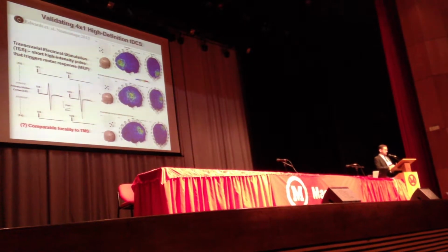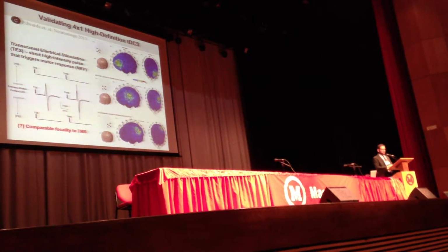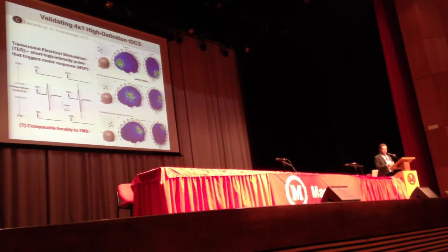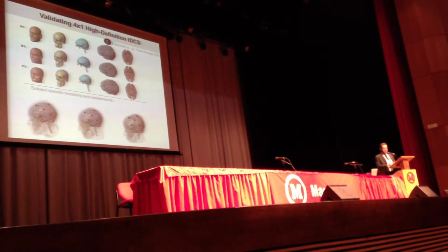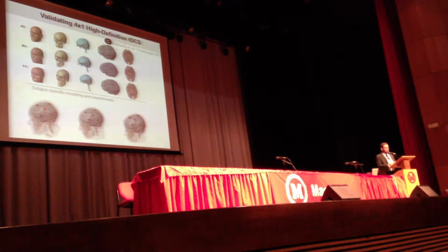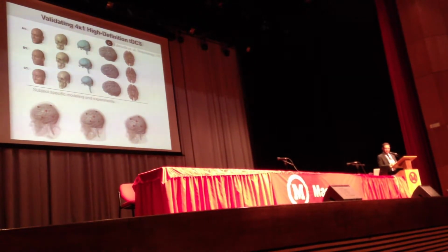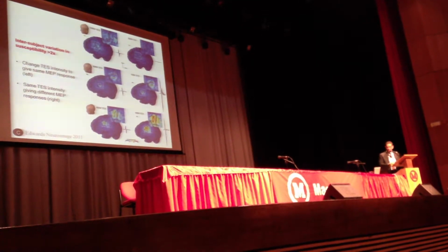Now in this paper, which is now published, we did a series of other experiments looking at incremental distances. We were not able to distinguish the focality of the 4x1 from TMS for all the gradations that we tried and all the experiments that we did. What was very interesting is we did these experiments on 3 subjects. One of those subjects was myself and 2 of the other investigators. And we also conducted models of each individual subject. We conducted MRIs from each individual subject. And what we found was very compelling. And so that's these results here, which I'll explain slowly.